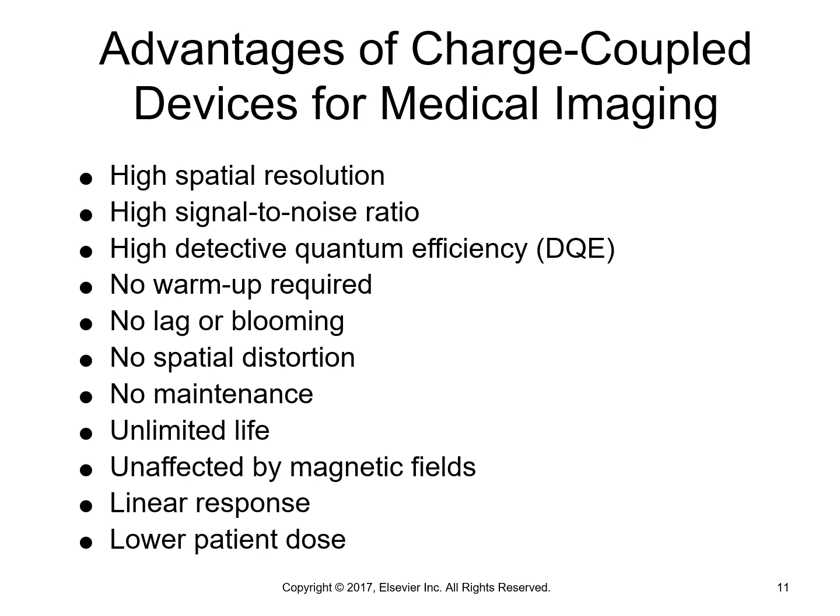Now, signal to noise ratio, what is signal? Signal is the intended data, right? I gave Ali the example of tuning into a radio station. You want to hear the song. What you don't want to hear is all the crackles and pops when the station is starting, when you're getting too far away from the broadcast tower.